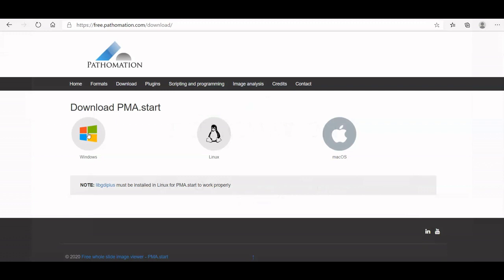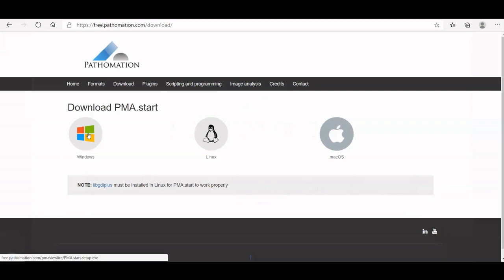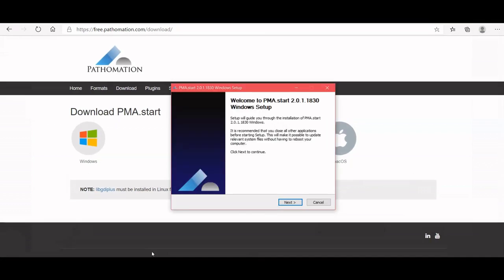Choose the Windows download file from our website. After the download has finished, a setup window for PMA.start will appear.